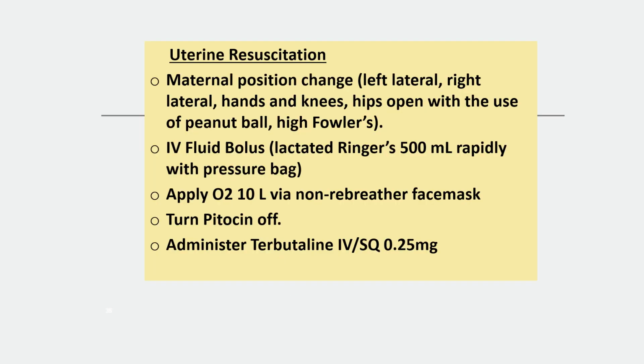So what do we do? We have patients that are having variables or late decelerations. I want you to first think about etiology. A lot of times with variables, we just broke the patient's water. It looked fine before, and now they're ruptured and they lost all this fluid, and now they're having variables. Let's start an amnio infusion. Let's see if they respond to that.